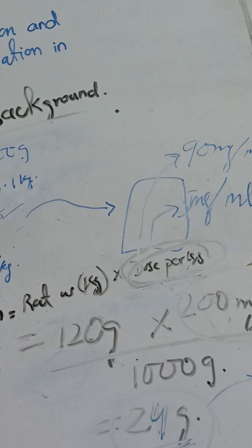So you have to inject the 90 mg so that he can remain alive, and you can observe how intense the seizures are, and then you do your experiment. For example, in an experiment they have told you that first you have to give the diazepam to your rat so that you can protect him from the seizures. After that you will inject the PTZ into him to observe the seizures. You will observe that the rat will suffer no seizures because he has first taken the diazepam. In the control rat, you will directly inject the PTZ and you will see the seizures coming on. So this is how you perform it.